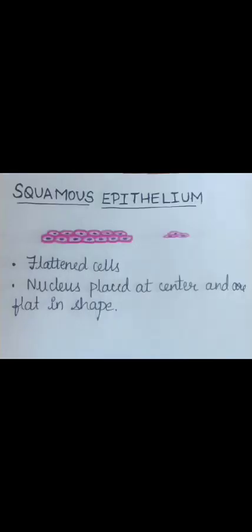Epithelial cells are classified based on their function, shape, and location within our body. Squamous epithelial cells are flat and thin, resembling scales and flattened pancakes. Their function is to facilitate diffusion and reduce friction. They are present in the lining of the blood vessels as well as the alveoli of the lung.